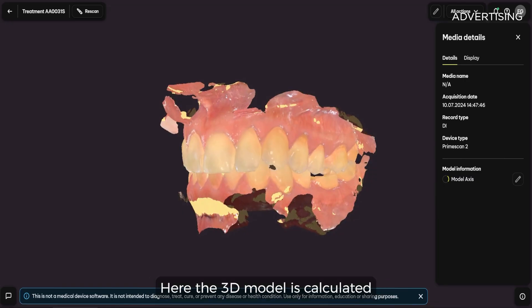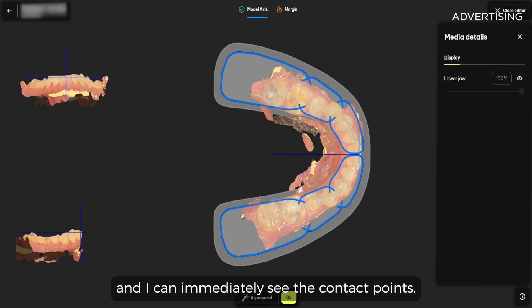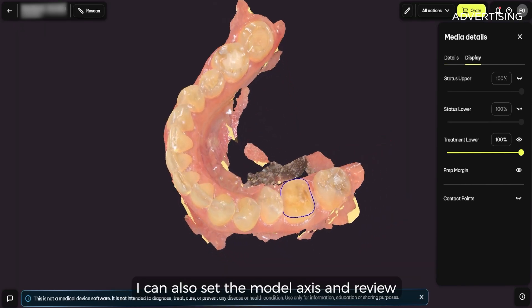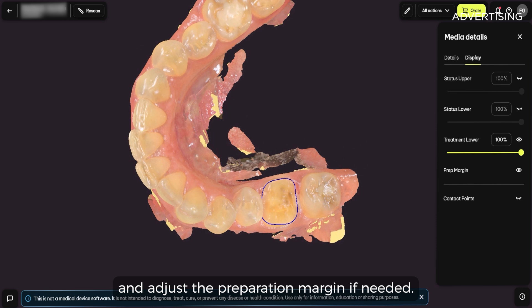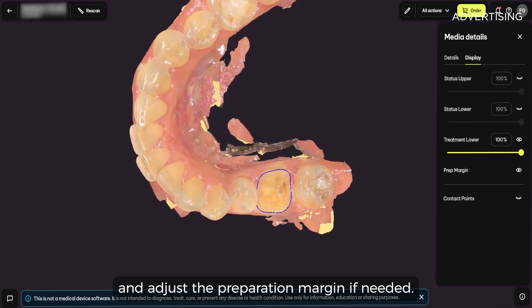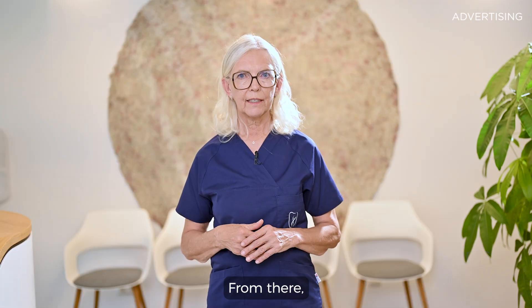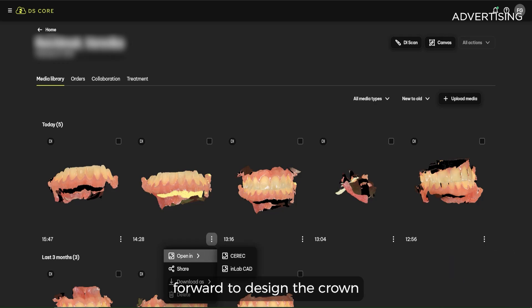Here the 3D model is calculated and I can immediately see the contact points. I can also set the model axis and review and adjust the preparation margin if needed. From there I can move forward to design the crown and continue on my workstation.